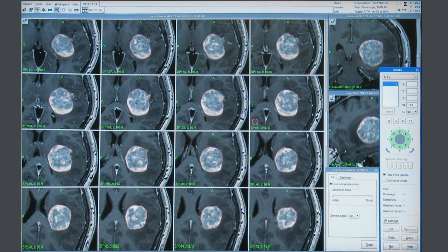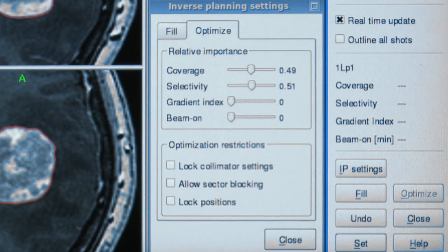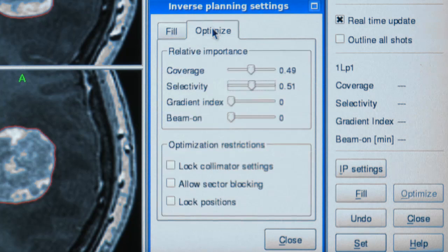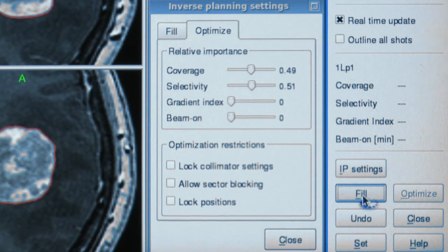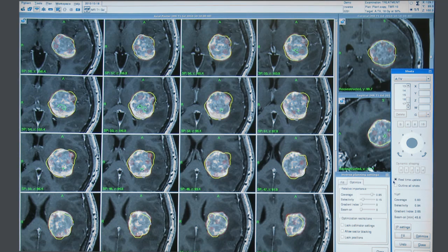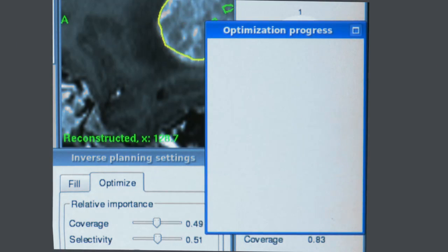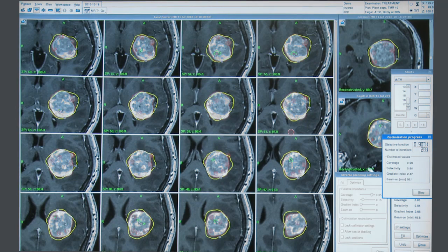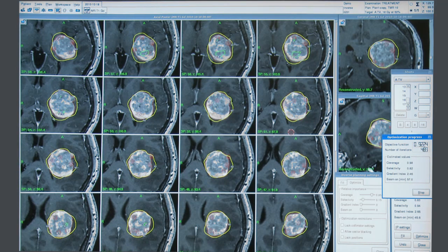Inverse Planning consists of two key steps by which a plan is created: filling and optimisation. The fill function places shots in the target and makes an initial dose distribution. The optimisation function then improves this plan by running thousands of iterations, leading to an increasingly conformal plan.